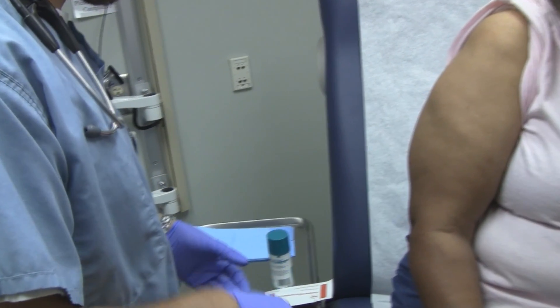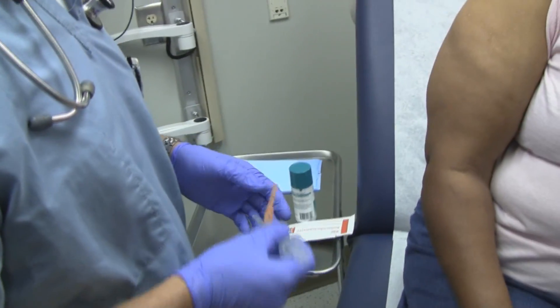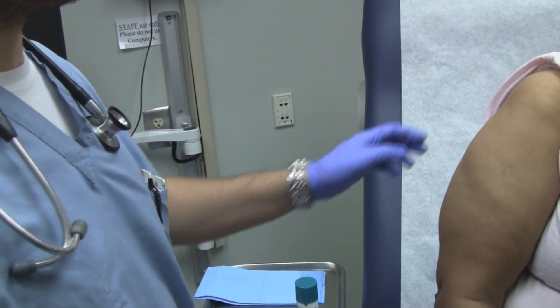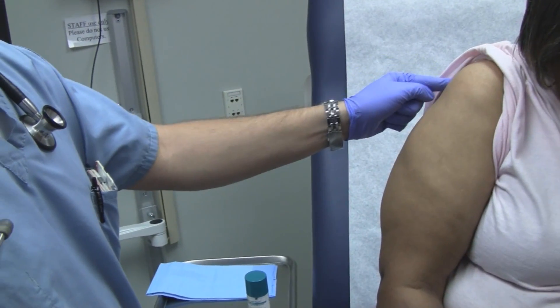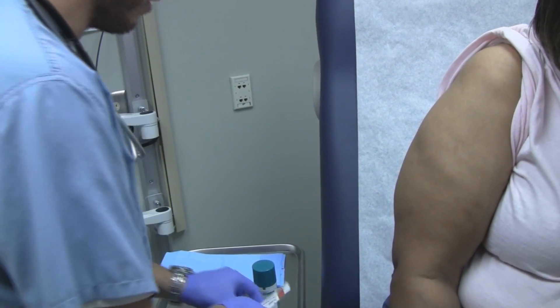So what we're going to do is we're going to try to give her some immediate pain relief. We're going to do a subacromial injection. There are several different ways you can do it: there's an anterior approach, there's a posterior lateral, and then there's just a lateral approach. We're going to do the lateral approach today.